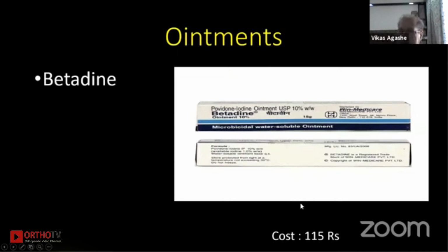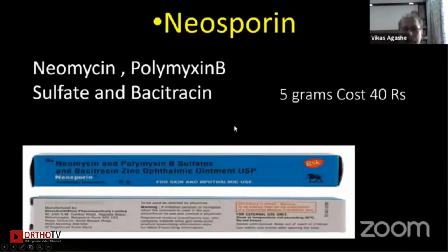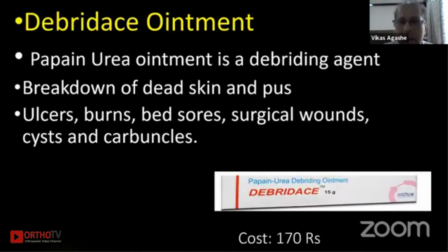We have extensively been using ointments like Betadine or Neosporin. Not that they actually prevent infection in a post-surgical wound, but very often they are used so that the gauze piece doesn't keep moving. But in open wounds, these ointments are extensively used.